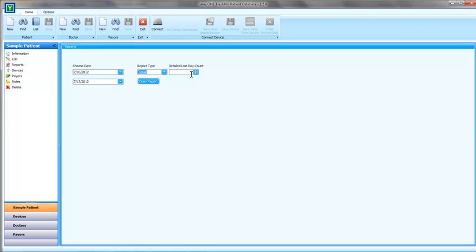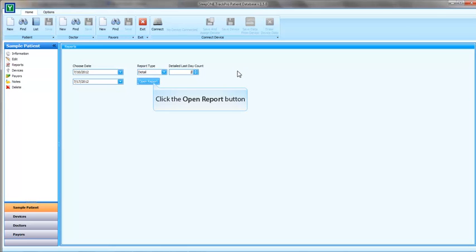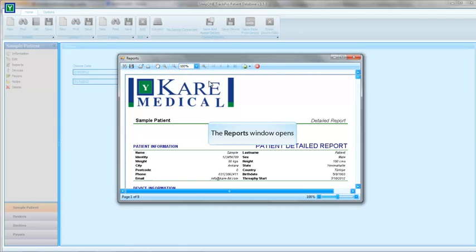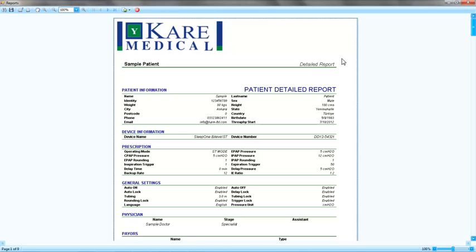In our scenario, I asked for a 7 day report timeframe, but only 2 days of detailed data. This is quite useful if you want to see a long timeframe of the patient on averages. You will see a summary report at the beginning.